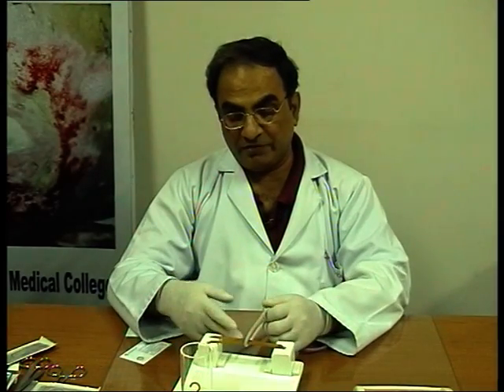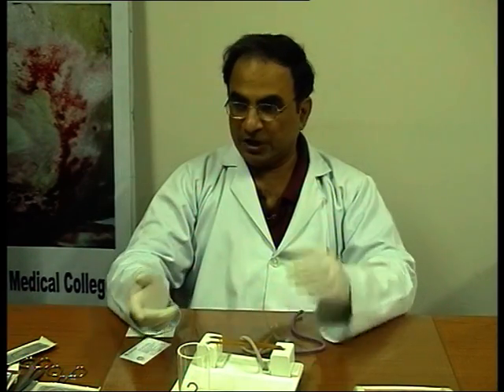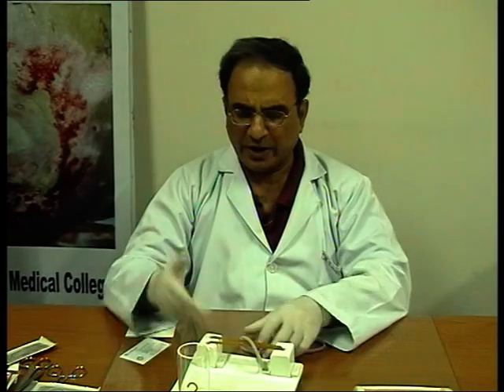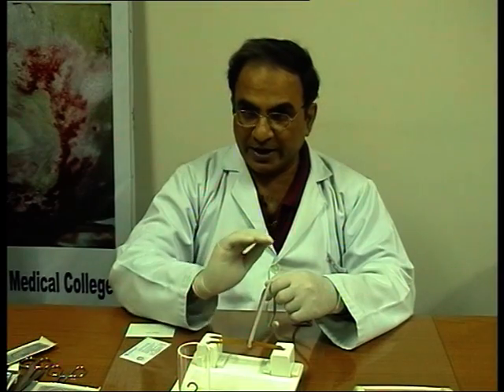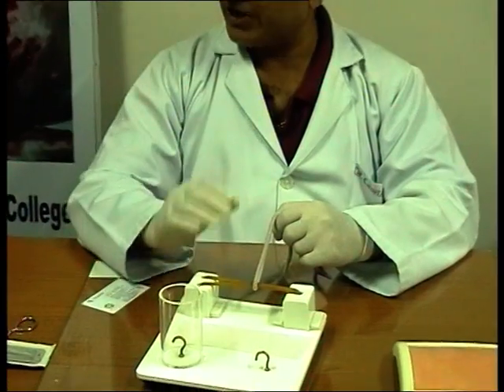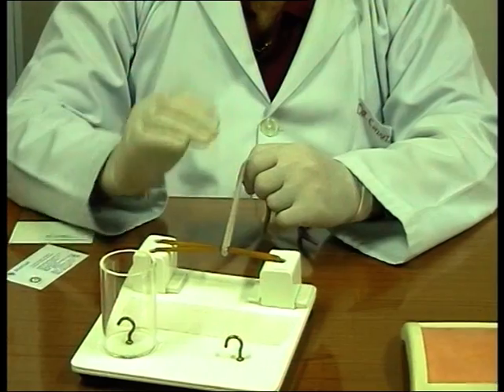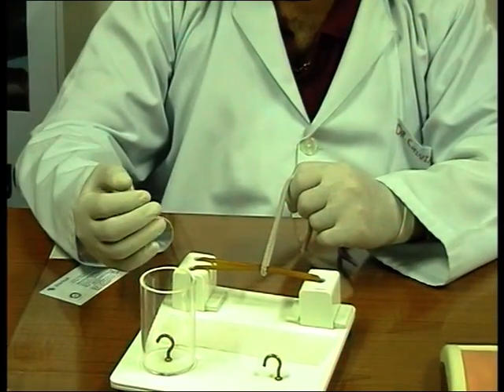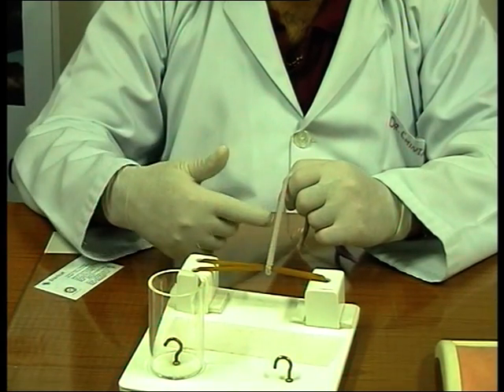Now, if you get bleeding in the depth, you apply too many artery forceps, and you're not sure which one to remove when. You worry that as soon as you remove it, there can be slipping, and you may not know which one to remove. It happens very commonly. In that situation, we try to put a knot which we can slide down beyond the instrument. So it's an attempt to put a slip knot. It should not happen accidentally. It should be a knot you put consciously.